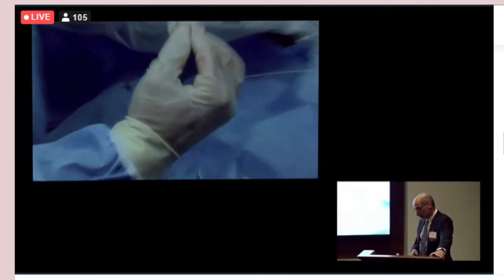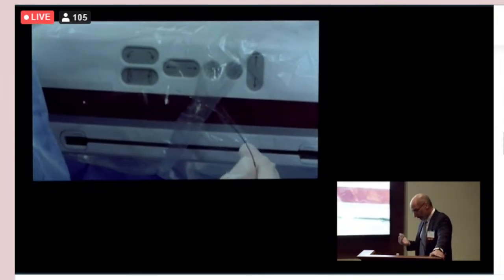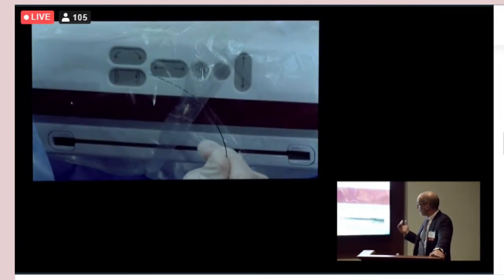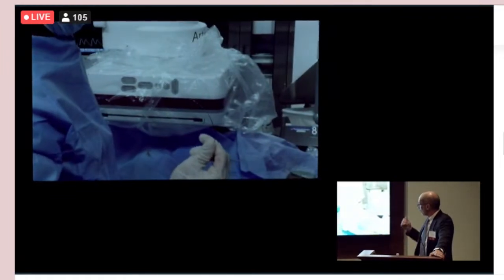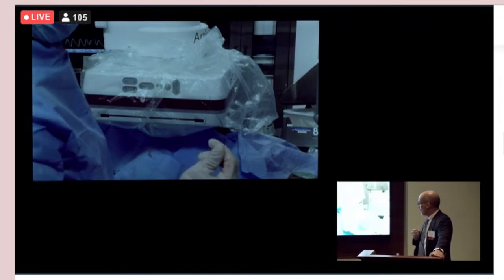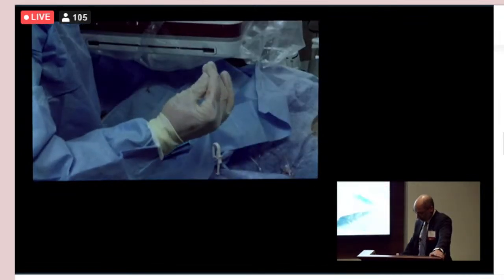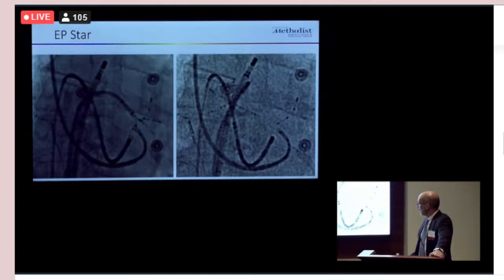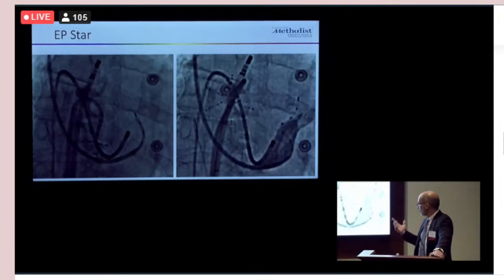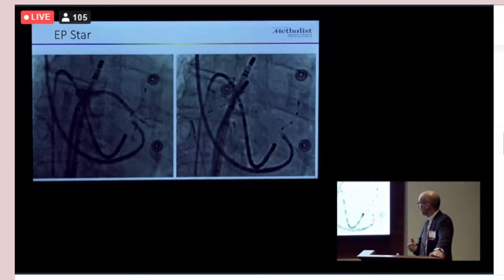In this case, we use a 2 French octopolar catheter. We're interested in understanding patterns of perimitral flutter and of mitral isthmus conduction, as well as other research opportunities that getting signals from the vein of Marshall gives you. So we will introduce that catheter at baseline into the vein of Marshall through that sheath. You kind of like to probe upwards. The whole thing will not get there. It's too big. It's too French.